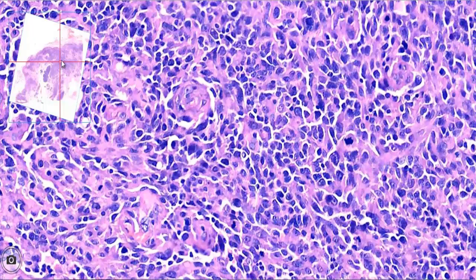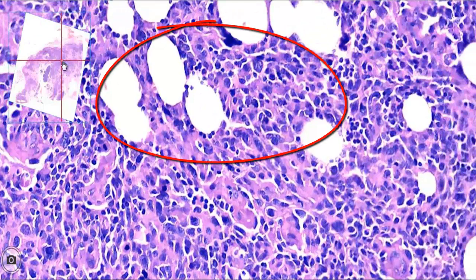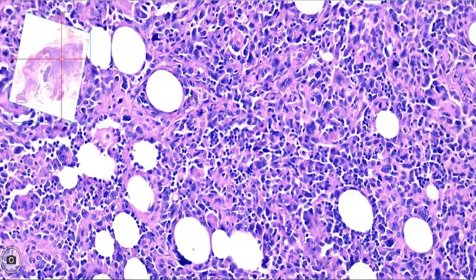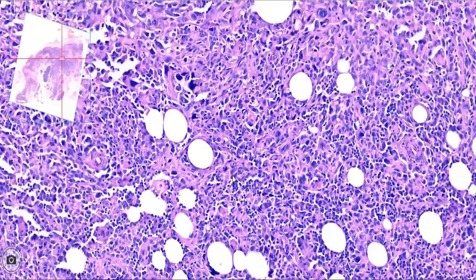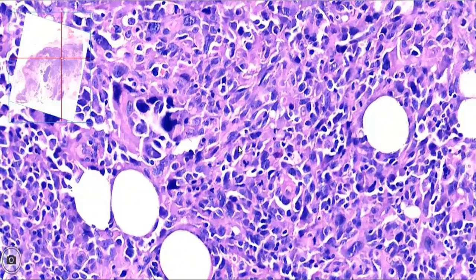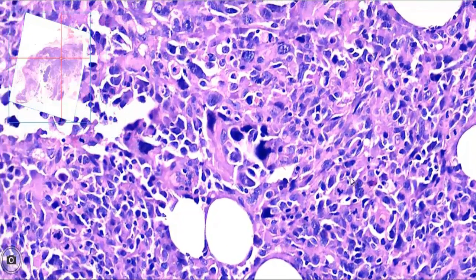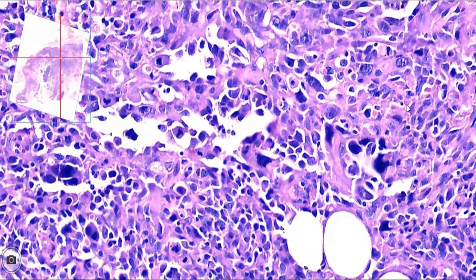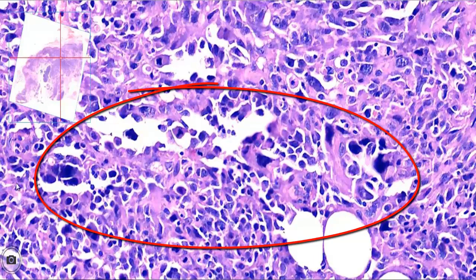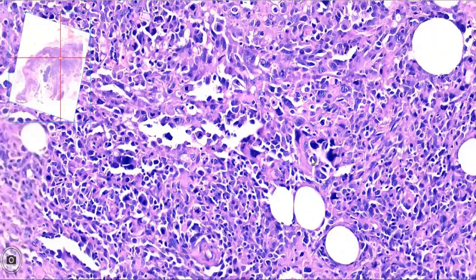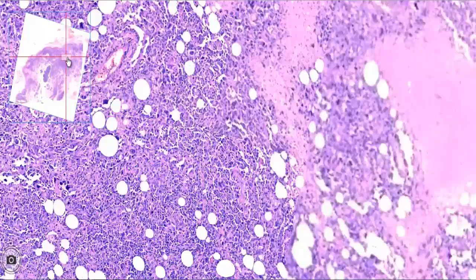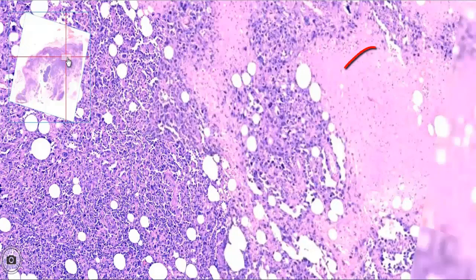When we go to other areas, we see infiltration of fatty tissue by tumor cells, and there is marked pleomorphism in the tumor, characterized by marked variation in size and shape of the hyperchromatic nuclei. On moving around the slide, an adjacent area shows coagulative type of tumor necrosis.